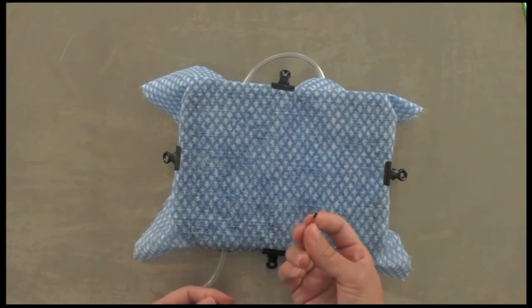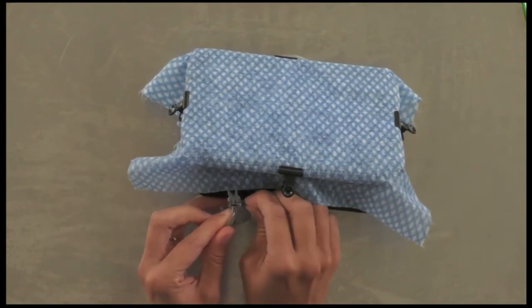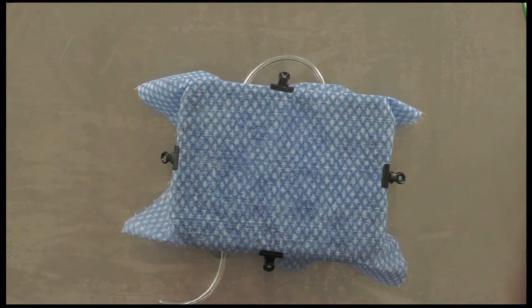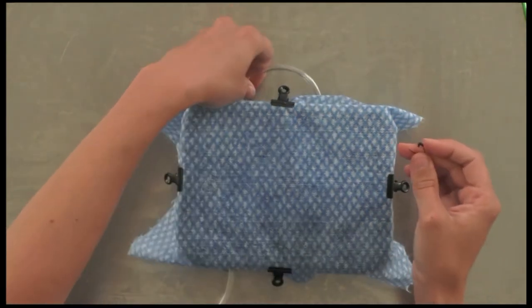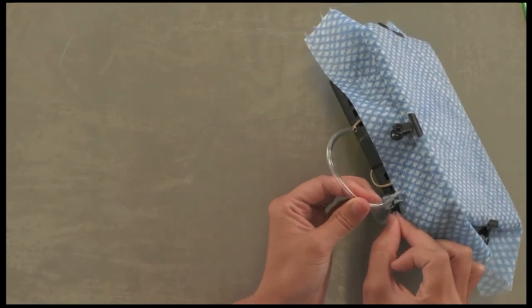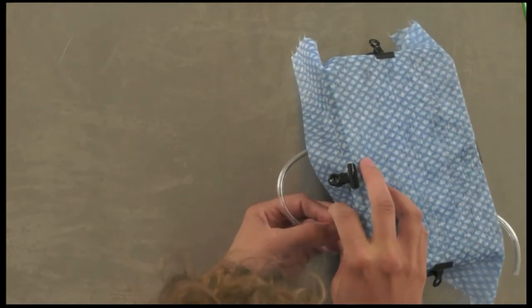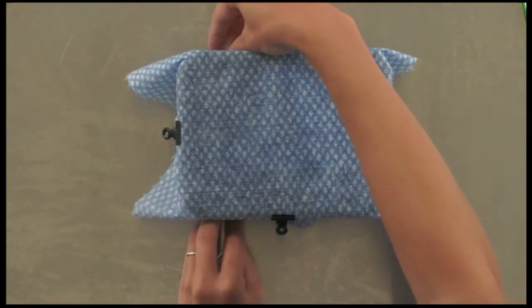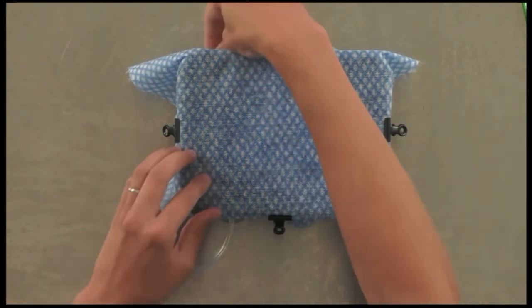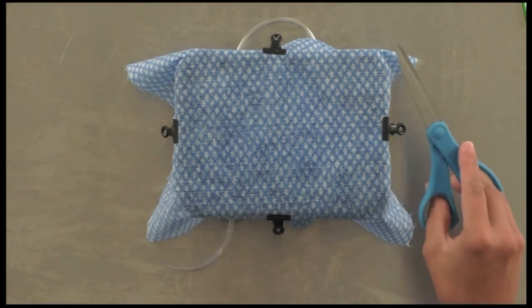If you want, you can insert a safety pin just lateral to where the suction cup is clipped onto the IV tubing to prevent it from slipping out — though the IV tubing size is usually appropriate for the suction cup, so you may not need this step. Don't hurt yourself doing this. Squeeze the suction cups down; on a metal table this works best, otherwise a bit of water under the suction cups works too.